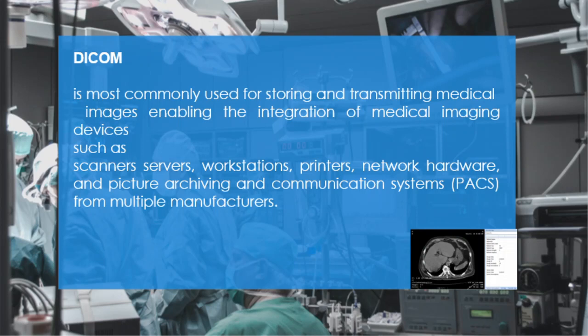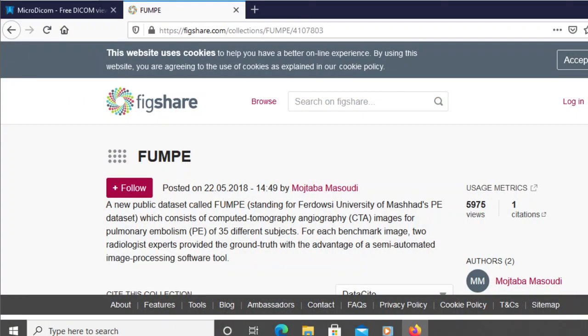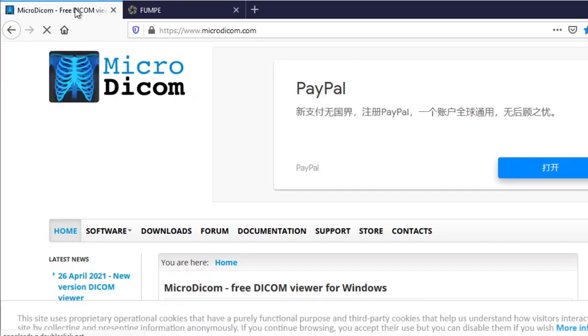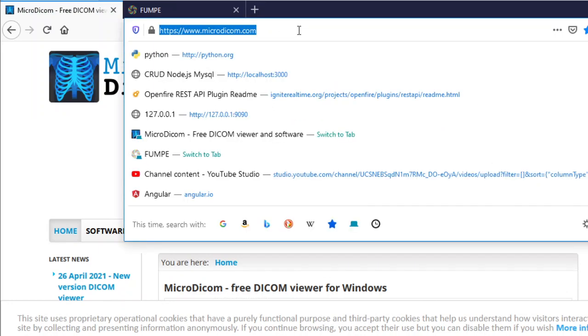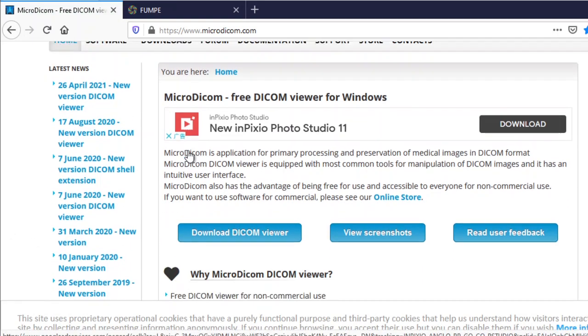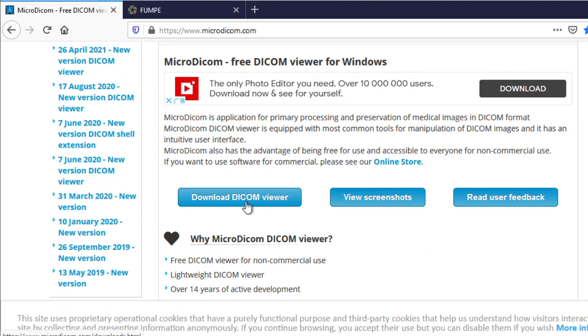When you go to a hospital, the imaging that flashes on the screen — the output of that process uses the DICOM format. To better understand, I'm going to show you these links. To see how this DICOM looks, I'm going to download a sample DICOM viewer from this site, microdicom.com, and download the DICOM viewer from this section.